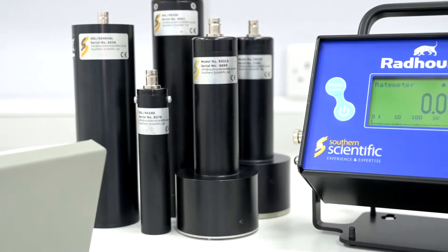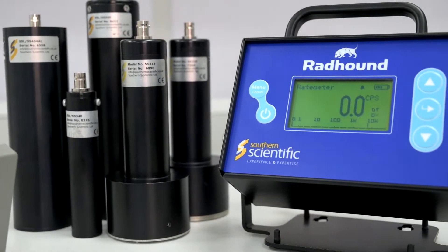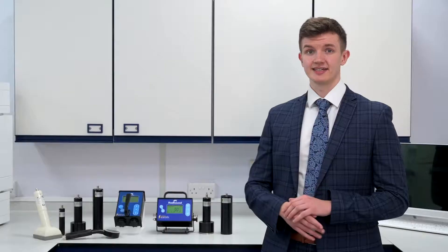Hi, I'm here today to talk about the Radhound. The Radhound is a multi-purpose bench rate meter. The instrument is designed with the user in mind. For example, the backlit LCD display means you can take readings in any lighting, and a solid steel casing means that your Radhound will perform reliably in even the most rugged of environments.